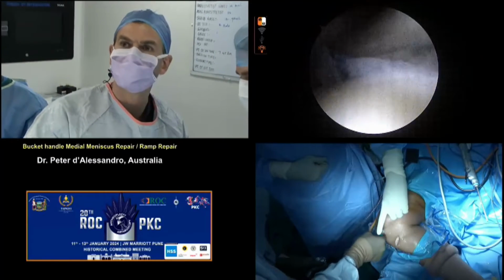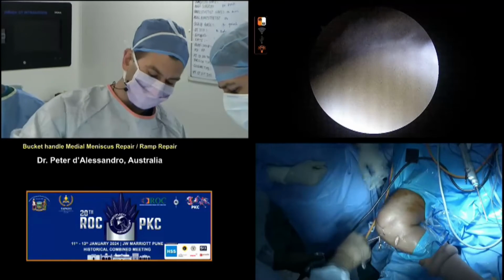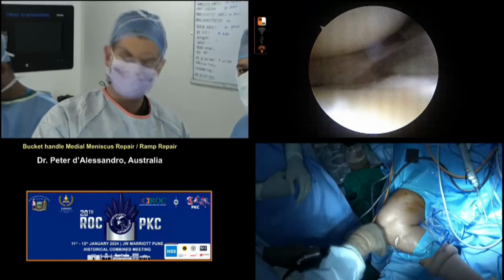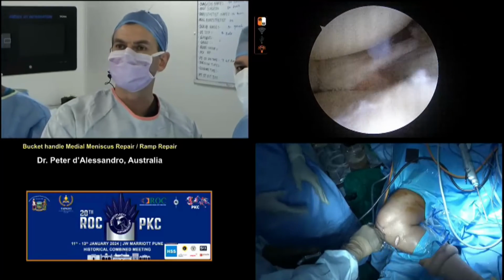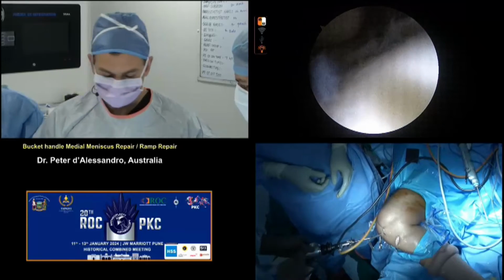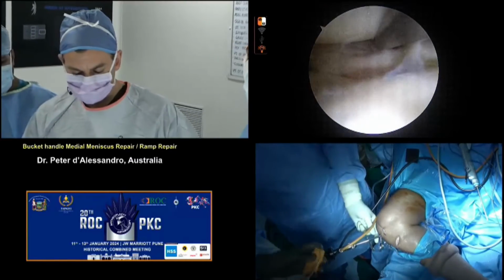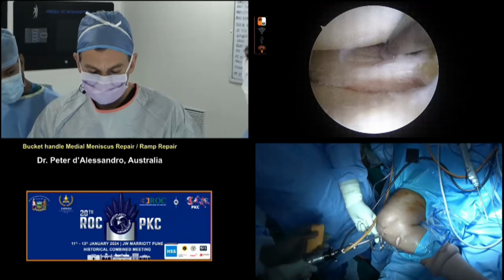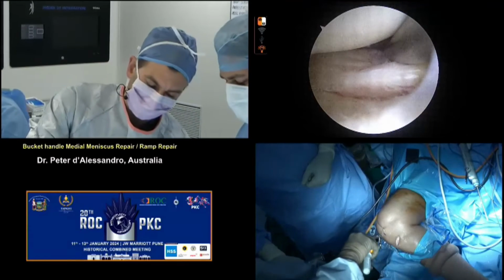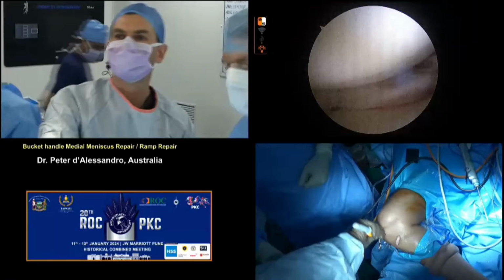Now, I don't know if you can see what I'm doing here, but I'm creating an accessory medial portal. This is basically a transpatellar tendon portal to change my angle. I'll never switch portals completely, because I think the big risk there is the vessel. So certainly we'll never put in anchors from the lateral side, but from this accessory central portal, I'm still happy that my trajectory is going to be in my favour, as we can see here.